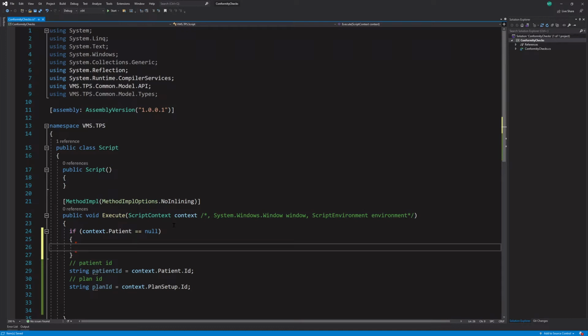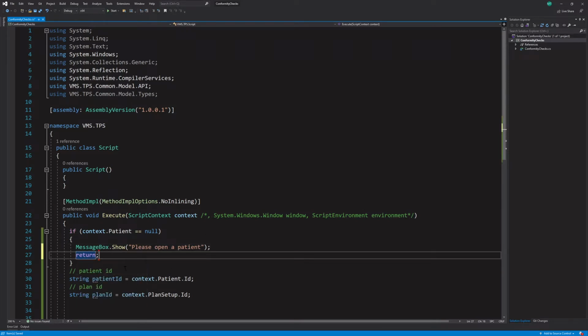We're already referencing System.Windows, so we can say MessageBox.Show, and it takes a string. There's a bunch of different methods that can take different things. You can see there's 12, right? So 2 of 12 has 2 different things. Anyway, this is going to take a string. Let's provide a message that says, "Please open a patient." And then we'll say return to end the script.